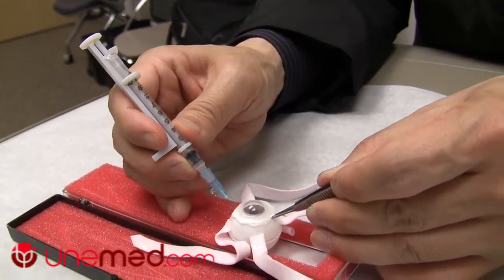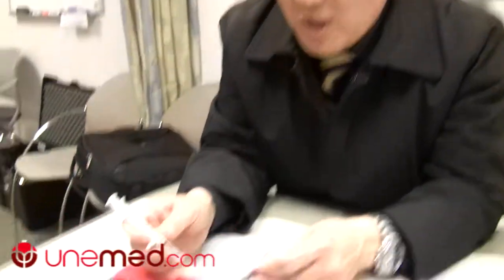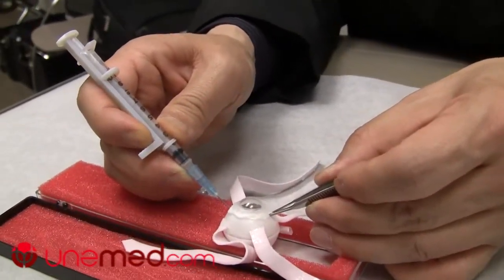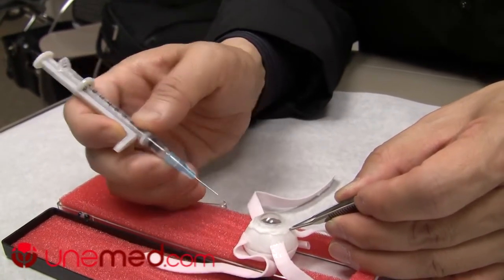Once preset, you just inject, push, and pull out — see how easy that is. For aspiration, same thing: hold on to the eyeball, inject, and aspirate the exact amount you want, just like that, and pull out. This makes the procedure a lot quicker, safer, and more precise.